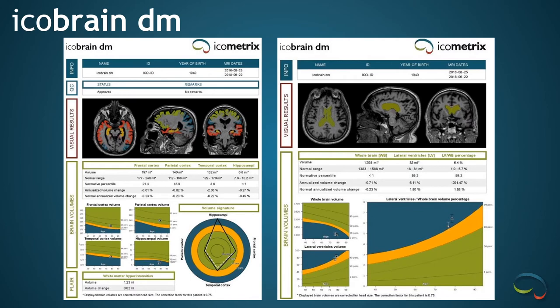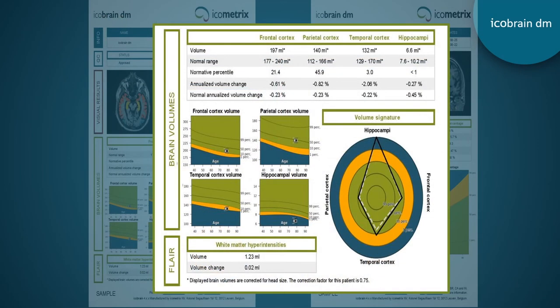Let's look at the IcoBrain dementia report. The pertinent anatomic landmarks for dementia quantified in this report are the frontal cortex, parietal cortex, temporal cortex, and hippocampi. The volume of these structures are listed, as well as the normal range and normative percentile. They also give us the annualized volume change and the normal annualized volume change expected for an age-matched healthy control. Below, we have plot graphs for visual demonstration. Anything in the blue zone is less than 1%. We're also provided the FLAIR hyperintense white matter volume. The volume signature gives us a bullseye graph — a nice visual representation of these findings. The outer blue zone is the one percentile, and the quadrilateral shape in the middle points towards any areas of statistical significance. The black shape is the current study, and the white dotted line is the prior study.